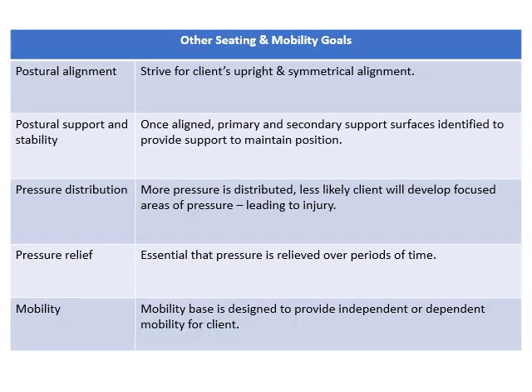Some other goals, of course, include postural alignment. So we're going to strive for the client's upright and symmetrical alignment. We want to provide stability, postural support. So once they are in line, there should be primary and secondary support surfaces to help them maintain the position.